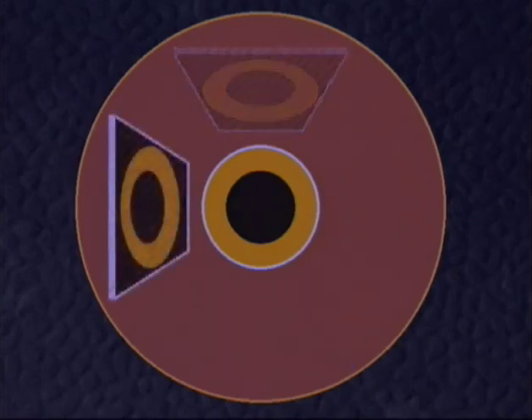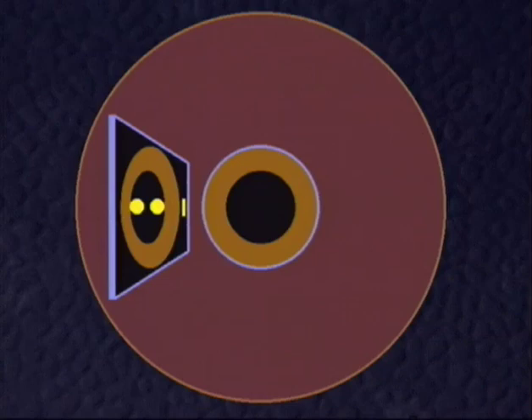However, when the mirrors are at the 3 and 9 o'clock positions, the horizontal diameter may be too narrow for the passage of all three bundles set side by side, and this may even occur with a wide pupil. In this case, one may use only one of the microscope bundles, but this means you have to sacrifice binocular observation. When insisting on binocular vision, illumination may be lost. This can be restored by placing the slit beam between the two microscope bundles, but then the light cannot be seen as an optical section.